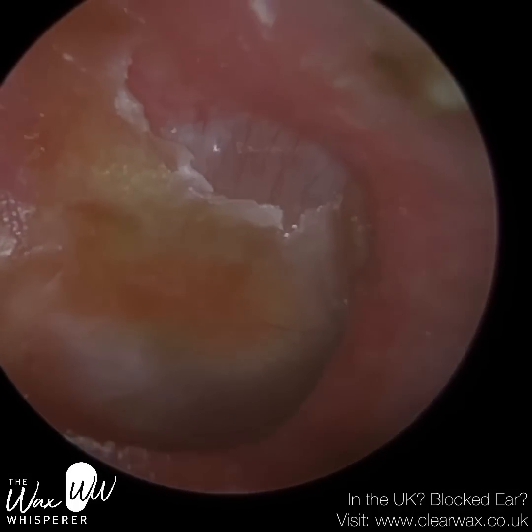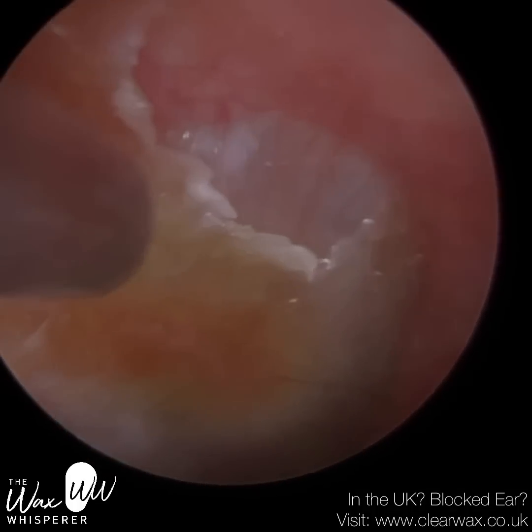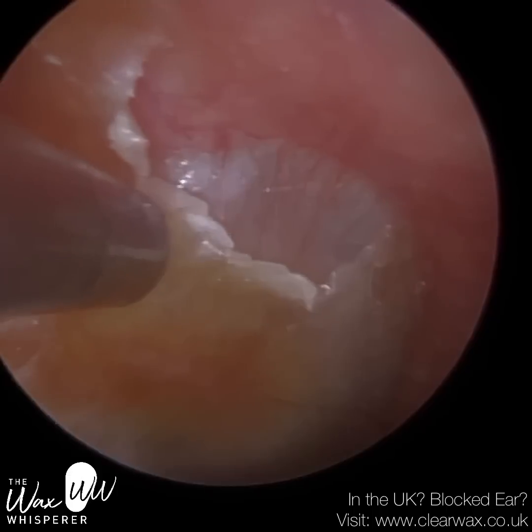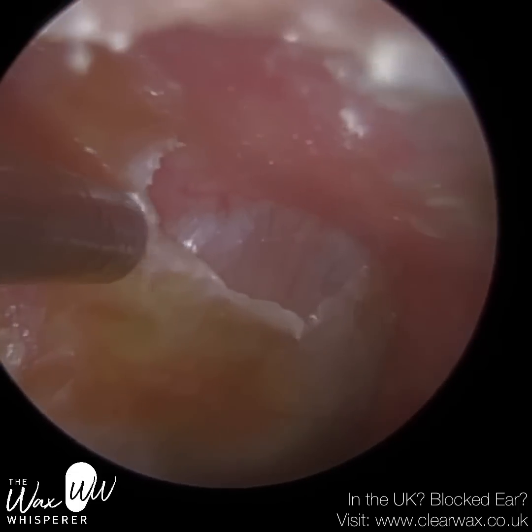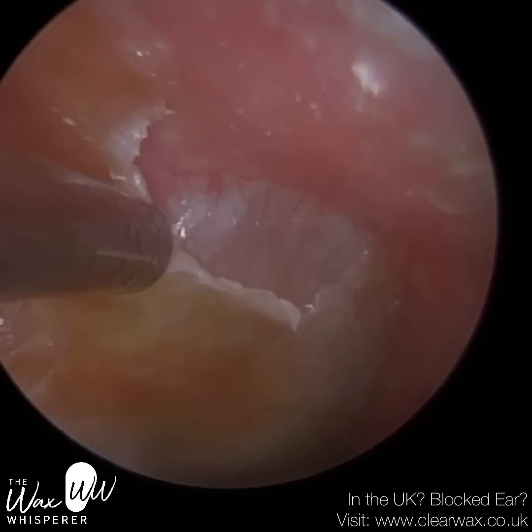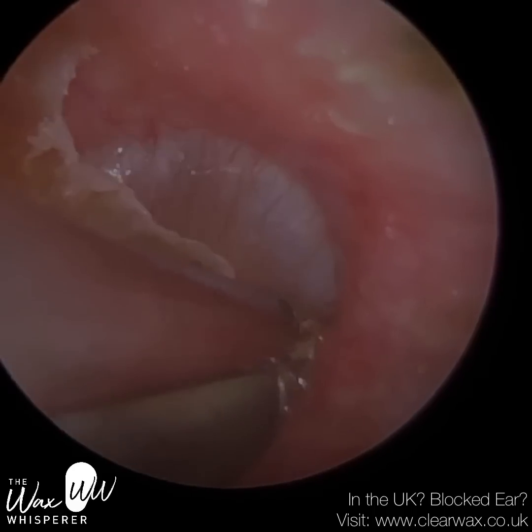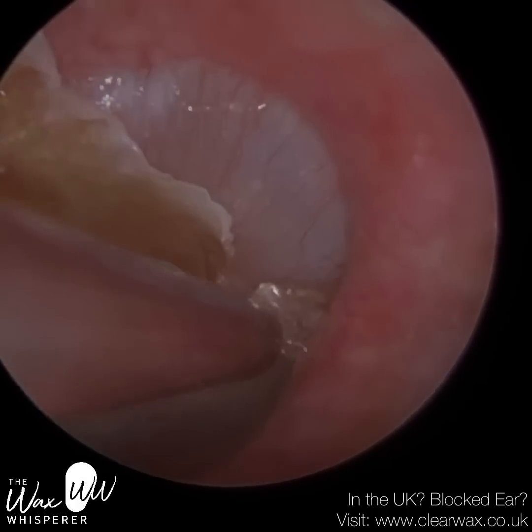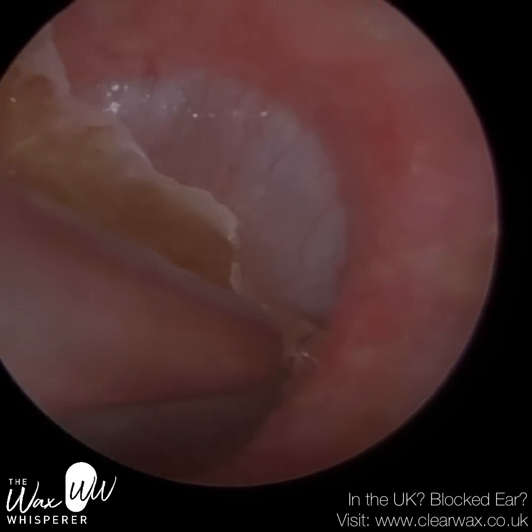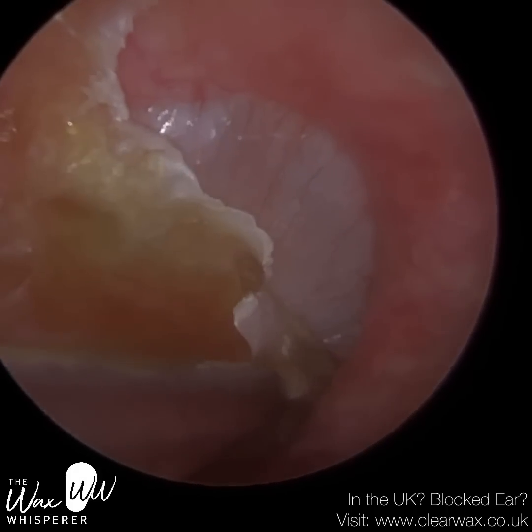I used some olive oil drops initially, as they are slightly acidic and don't contain water — better for this patient because of their otitis externa. But although it helped slightly, I had to use sodium bicarbonate drops in the end. Sodium bicarbonate drops are water-based and slightly alkaline in solution, so it's not ideal, but I had no choice. I did ensure I removed all the excess sodium bicarbonate drops from the eardrum and out of the ear canal, and the patient will use acetic acid spray to help re-acidify the ear.